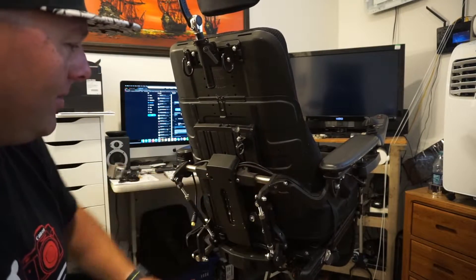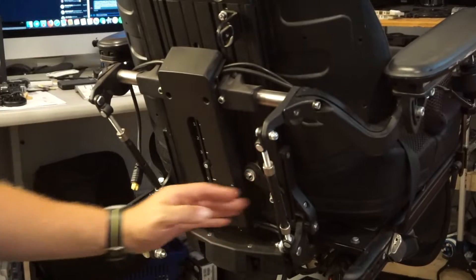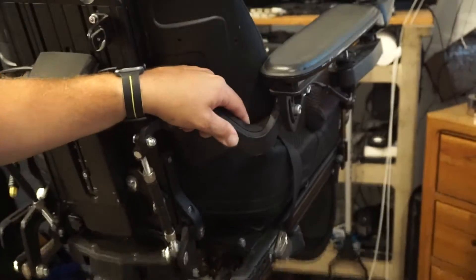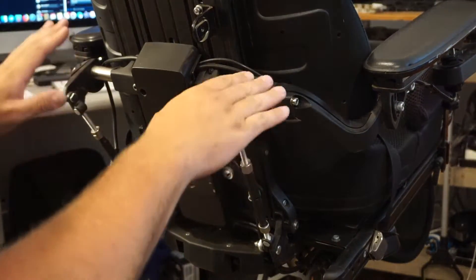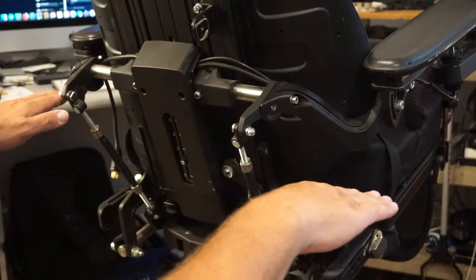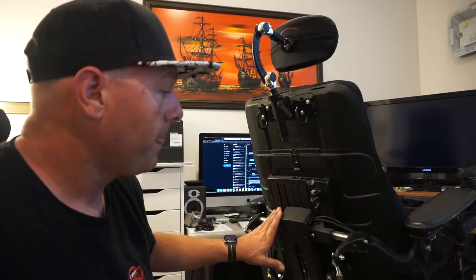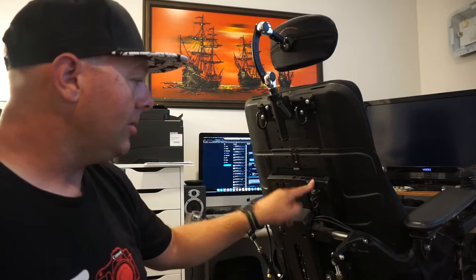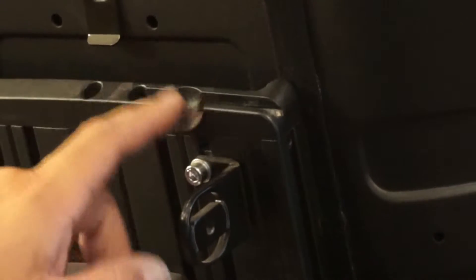There are a few different factors involved in adjusting armrest height. On these chairs you have two struts on the back, and these are what change the angle of your armrests. But when you change your seating height you're going to have to adjust these as well, otherwise your armrests are going to be all weird. It is possible to do this while someone's sitting in the chair — it's best if they can make sure their elbows are not on the armrest while you're doing it. I was going to show the allen wrench that's normally stored right here, but it's missing on this chair.